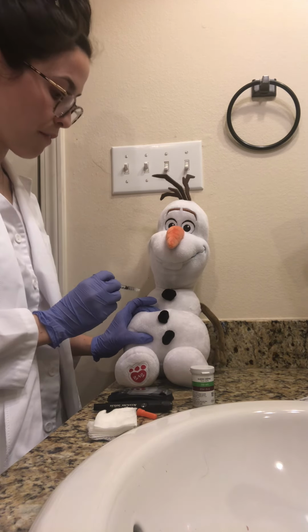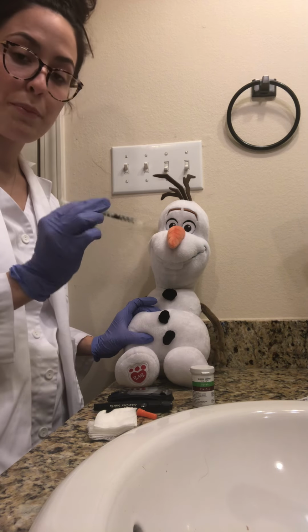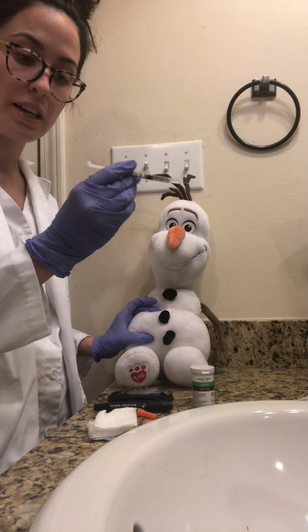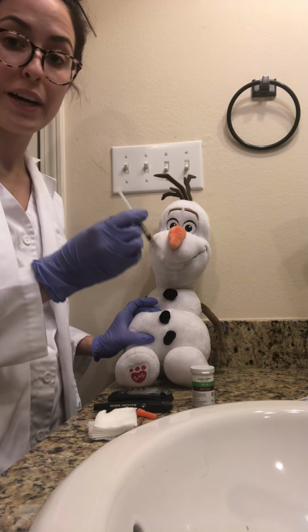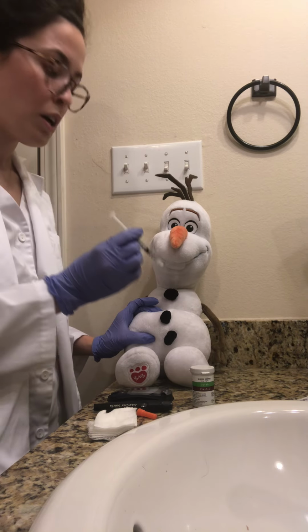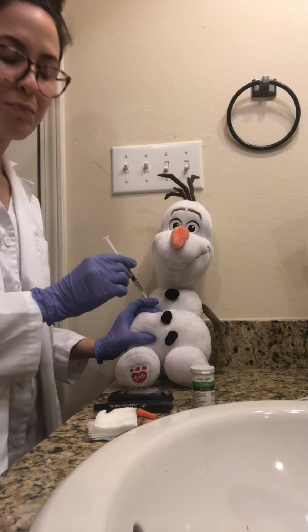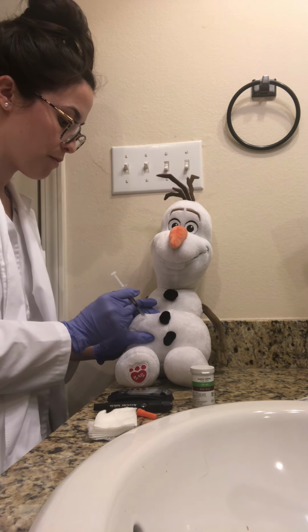All right, Mr. Olaf, and also important whenever you're going to inject insulin, you want to make sure to keep your fingers kind of like a dart on the hub part and not the plunger, because if you did it like this, you might actually make the insulin go out prior to getting in the subcutaneous tissue. So I'm going to hold it like this, and then I'll put my finger on the plunger once I get it in the skin. Okay. Mr. Olaf, big stick, okay?